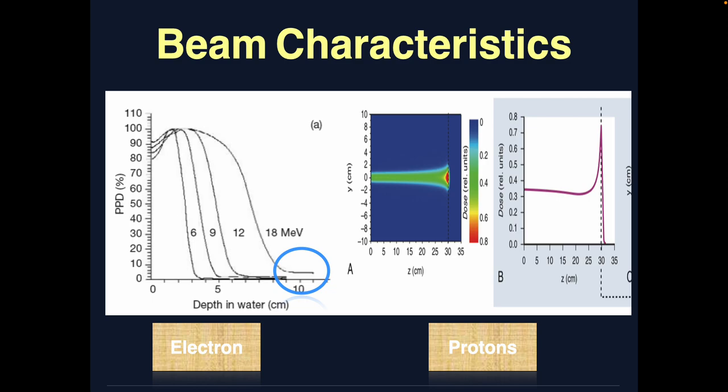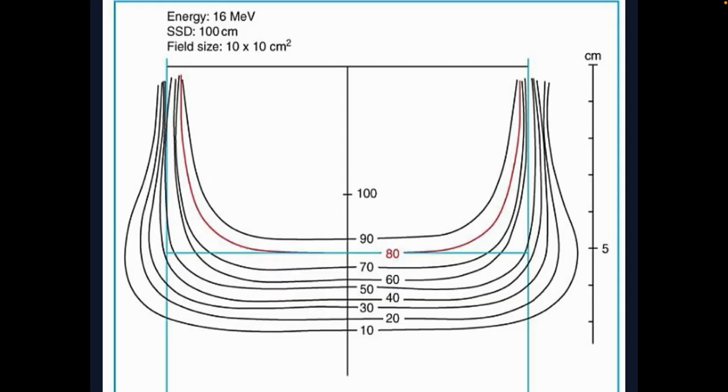Maybe you can have another lecture with proton beam therapy, where there is the deposition of the energy at the end of the curve. The dose on the surface of proton is also different, and there is also a lot of concern regarding the skin dose in proton beam therapy, but not the case of electron beam. So there is a major difference between both. So please don't be confused. I know it's a silly note, but in the exam, I don't know what's going on.